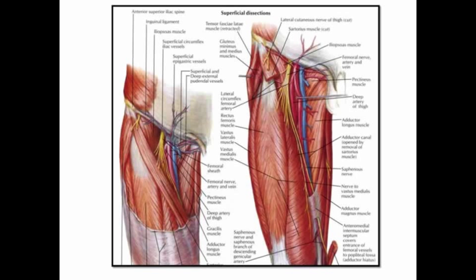What's important to remember also is that sometimes the artery, as imaged here, can lie just lateral but also a little bit superior to the vein, and you can adjust the positioning of the patient, so frog-legging them, externally rotating the hip, can allow the artery and vein to come off of each other so that it's easier to access.